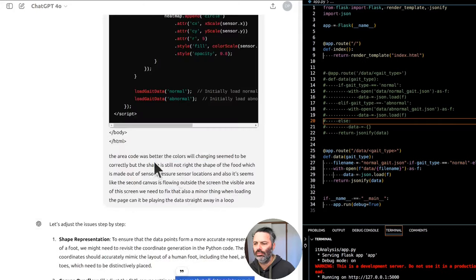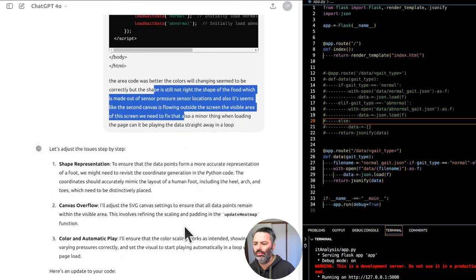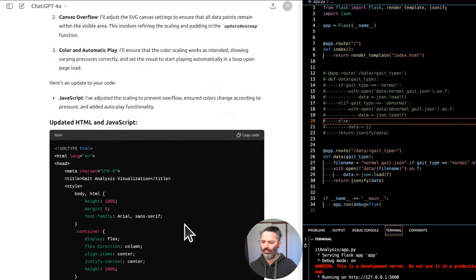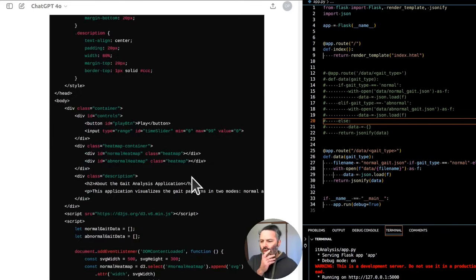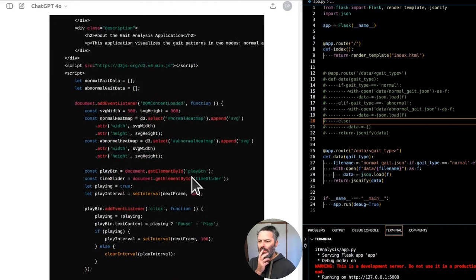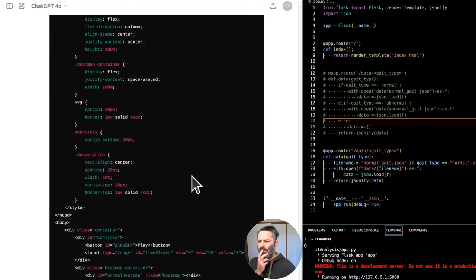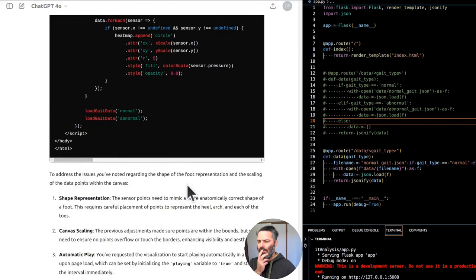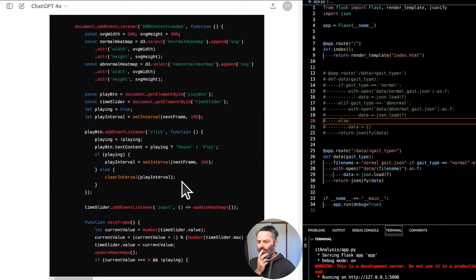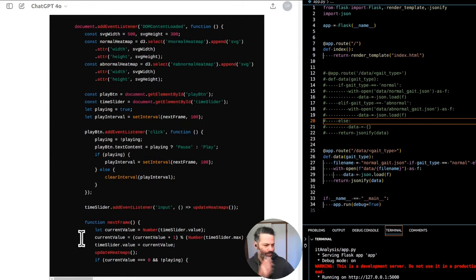Mathematical details. 1. Foot outline. The foot outline is represented as a series of 2D coordinates, x, y, that approximate the shape of a human foot. These points are chosen to capture the overall geometry of the foot, including the heel, arch, ball, and toes. 2. Sensor positions. Pressure sensors are placed at specific coordinates within the foot outline. These sensors are positioned at key anatomical landmarks where significant pressure changes occur during gait, such as under the heel, along the arch, and at the ball of the foot and toes.